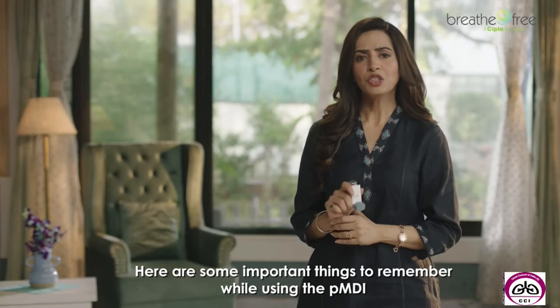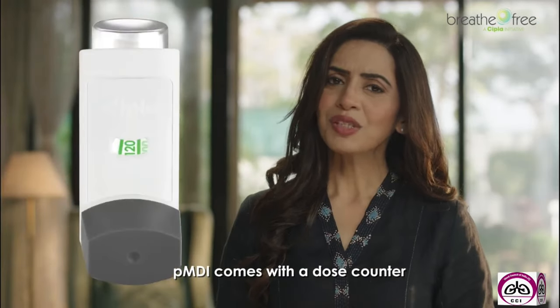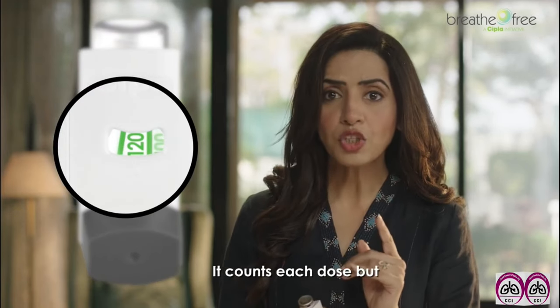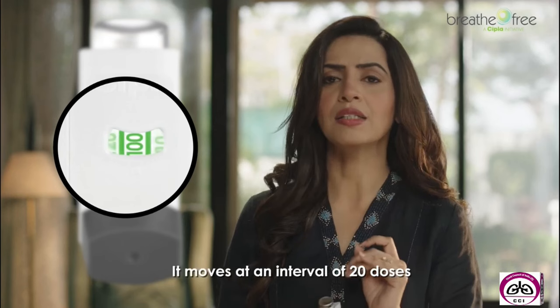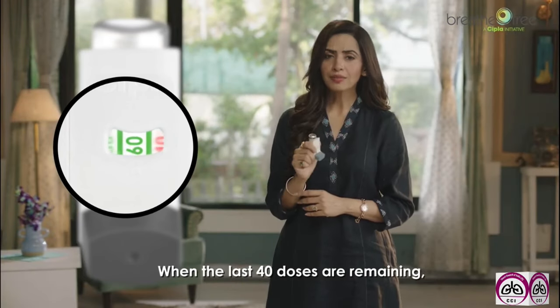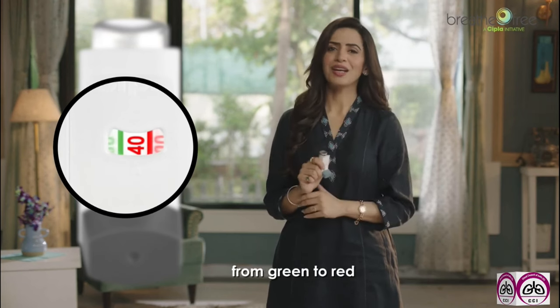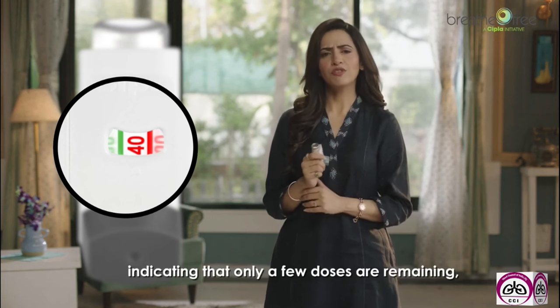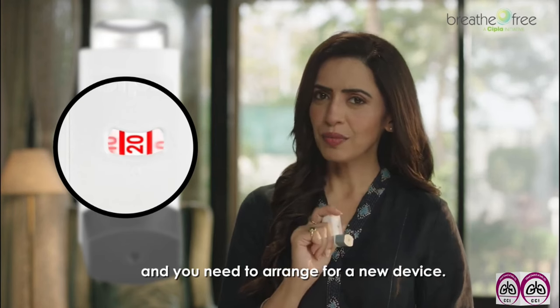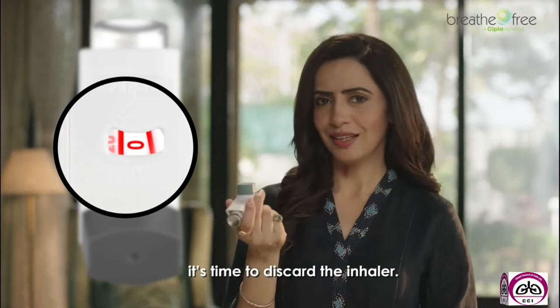Here are some important things to remember while using PMDI. PMDI comes with a dose counter, which explains how many doses are remaining. It counts each dose, but it moves at an interval of 20 doses. When the last 40 doses are remaining, the color of the dose counter ring changes from green to red, indicating that only a few doses are remaining and you need to arrange for a new device. When the dose counter reads zero, it's time to discard the inhaler.